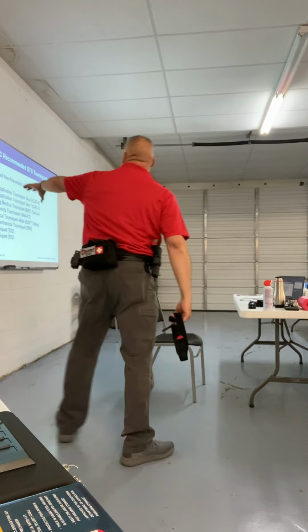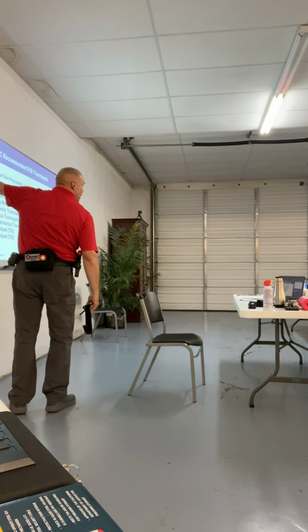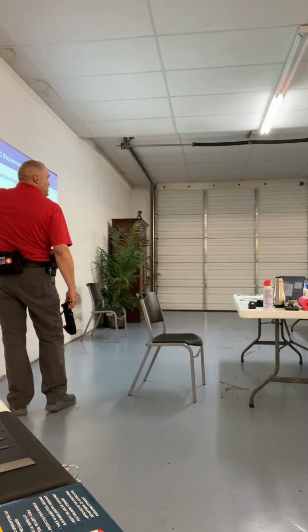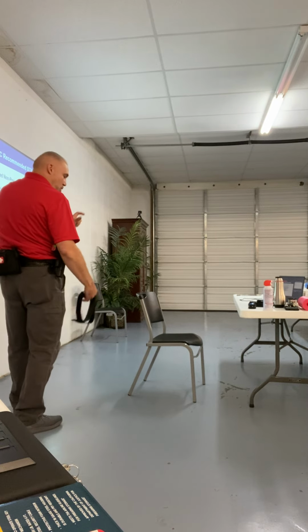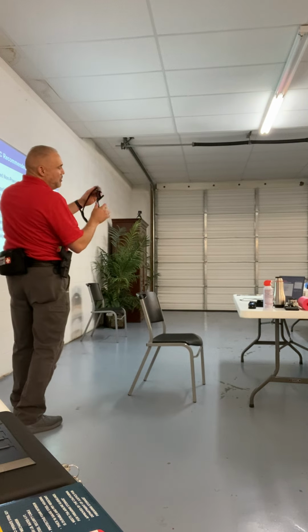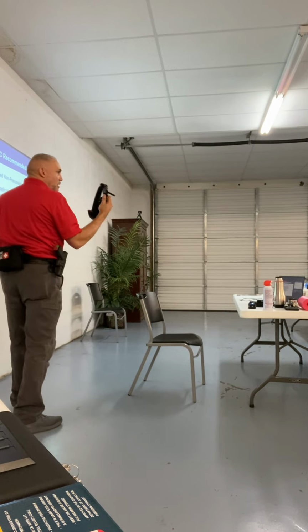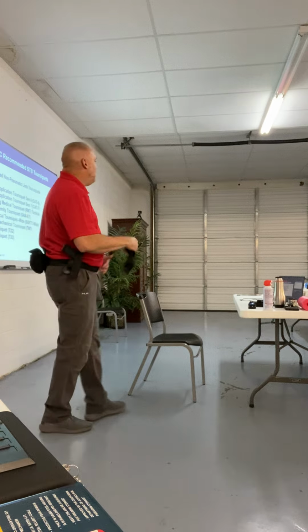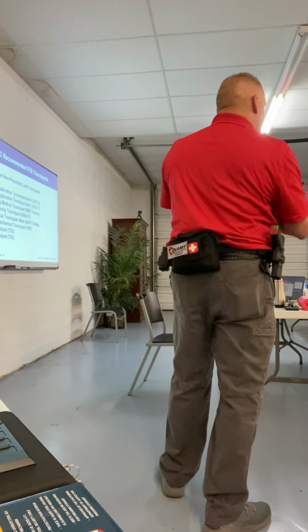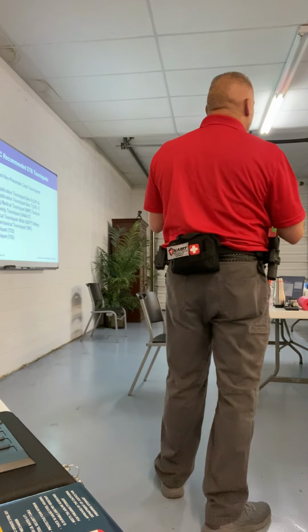So you also see that they have Gen 6 tourniquets up there, right? The way they are different, the Gen 6 has a white time tab on it, and the Gen 7s have gray time tabs. So this is a new gen. That's right, it's a Gen 7. Every time they come out with a new generation, they make something better on it, whether it's the windlass or the internal strap, but they have the patent.